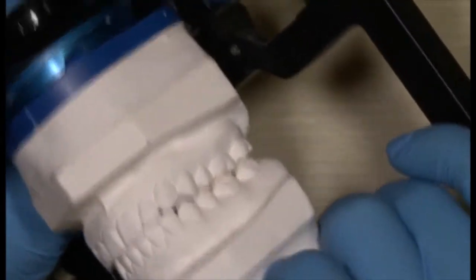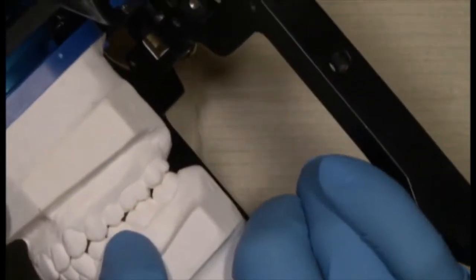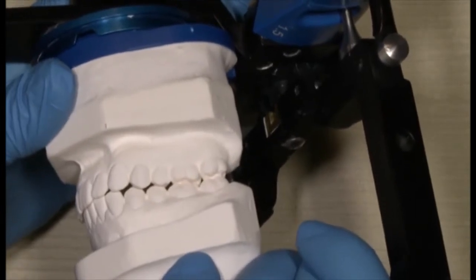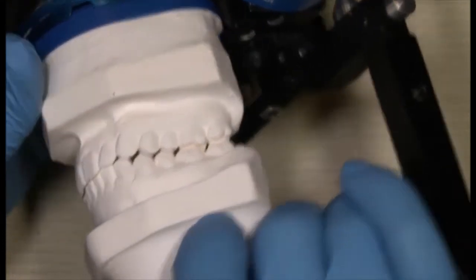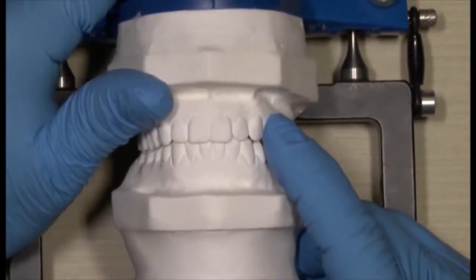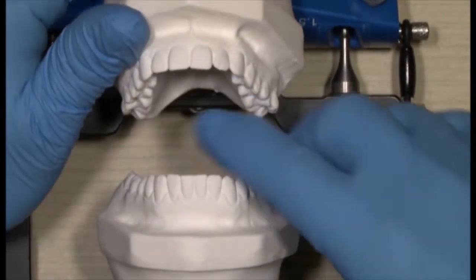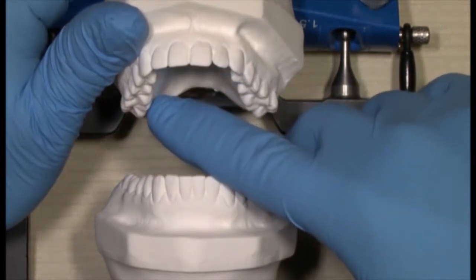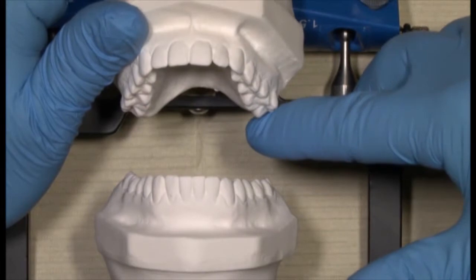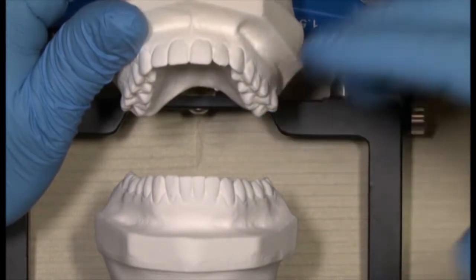When you look at the models, it's pretty apparent that there's quite an opening on this side. The left side doesn't really touch at all. So the question is, will our goals of equilibration be achievable, or do we have to take too much away from the teeth that currently are beginning to contact before we can get this left side into contact?